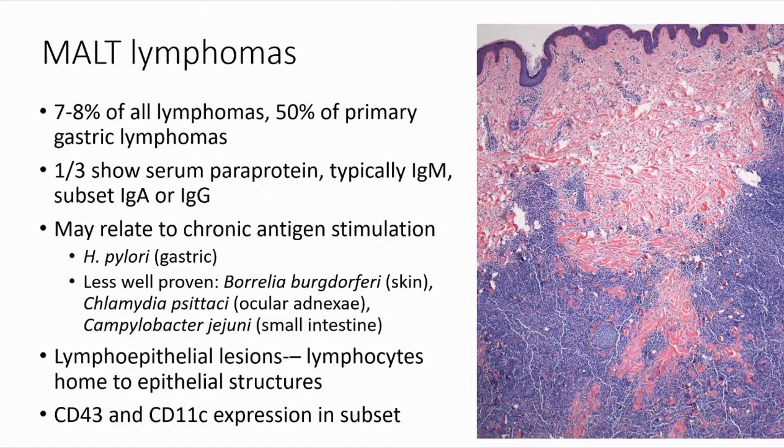Overall, we don't have anything perfect. We don't have anything like cyclin D1 or co-expression of BCL2 and BCL6 to really nail the diagnosis, but oftentimes they will express CD43, and so that can be helpful when that's expressed in the B cells aberrantly.